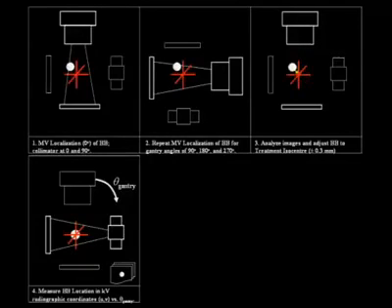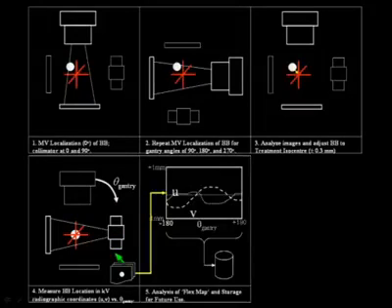And once this is done, we can perform a calibration acquisition for the IGRT system. In this case, this is cone beam CT. The imaging system will then record and define a function which we call a flex map that shows the apparent motion of the object on the imager as the components, the arm and flat panel of the device, flex and torque as the gantry rotates around it.